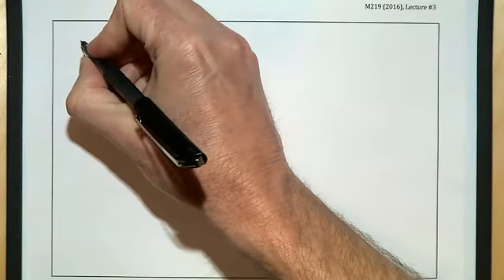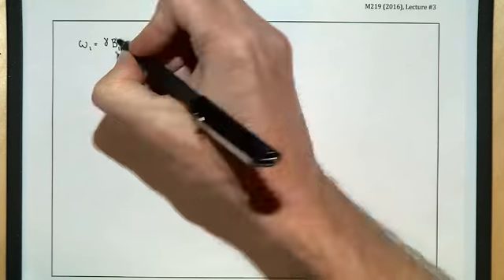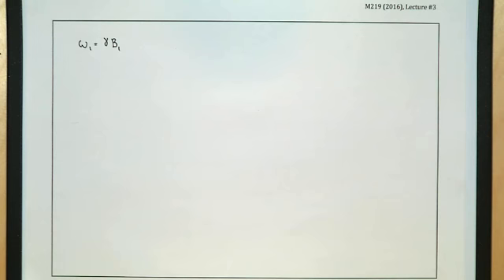Okay, so do you guys agree or appreciate that this relationship is true? Just another B field, right? Why wouldn't it be the case? And all I want to do is show you how we go from this expression to understanding how we control the flip angle, or how we maybe choose the flip angle.